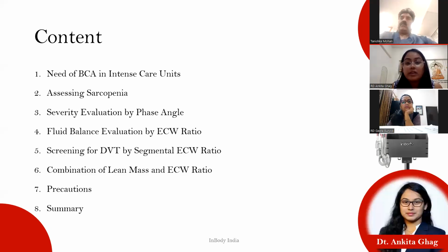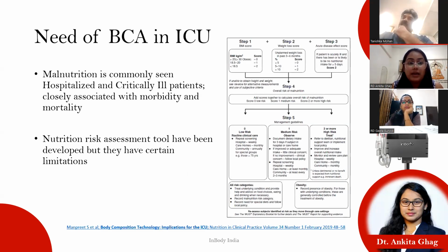with bioelectrical impedance analysis technique. And what are the precautionary steps? What are certain precautions one needs to take while doing a BCA? And certain summary pointers. So, understanding the need of BCA in ICU.